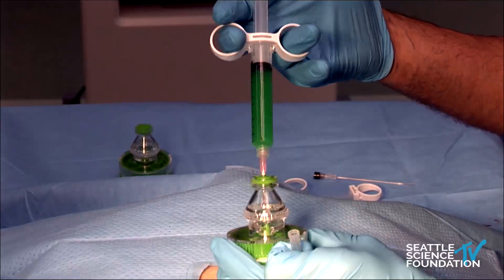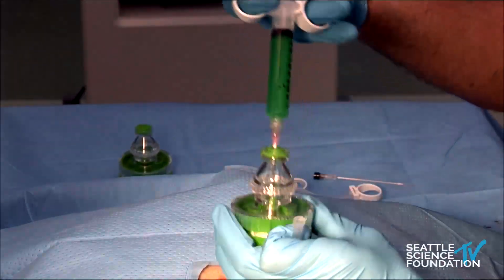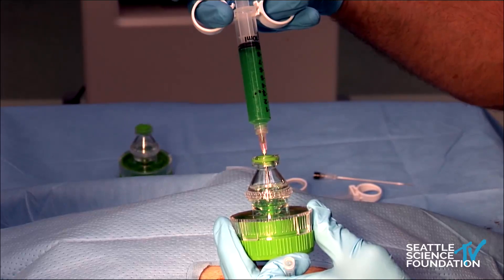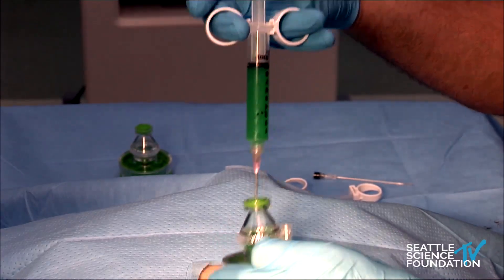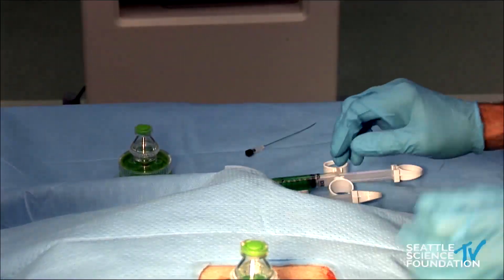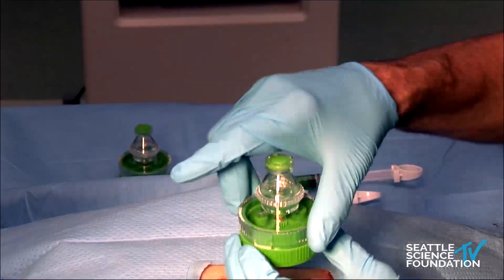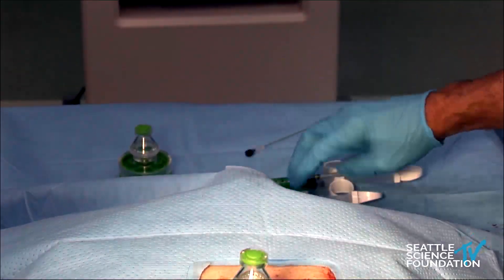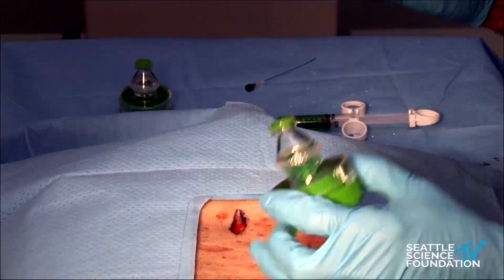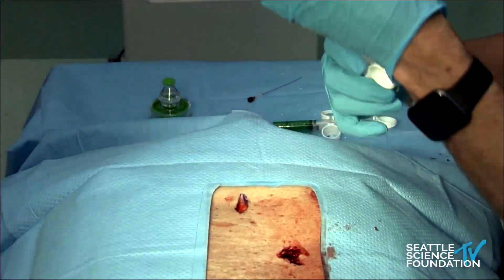This is followed by injection of the cellular material — six million cells derived from the hypoxic region of bone marrow adjacent to the discs, from newly donated bodies donated to the tissue bank. After this is applied, the mixture is mixed for another 30 seconds, and then it is withdrawn and placed in a syringe.